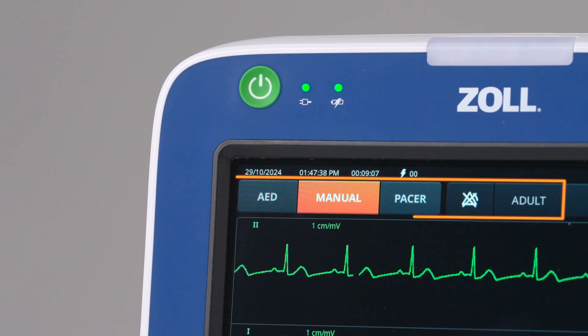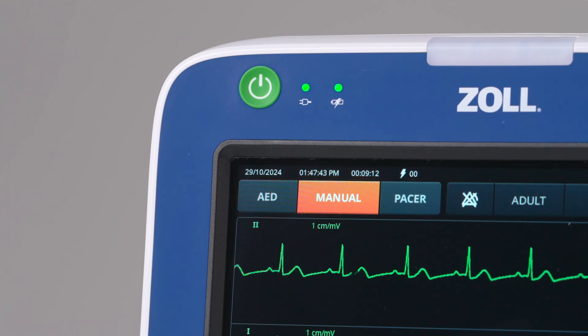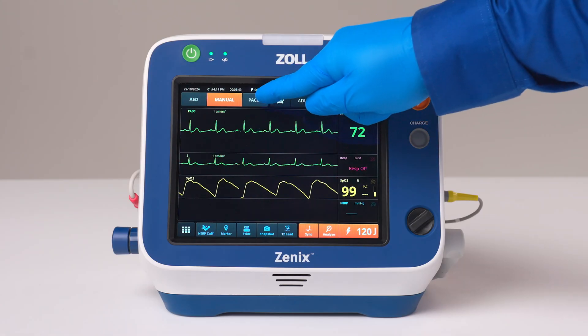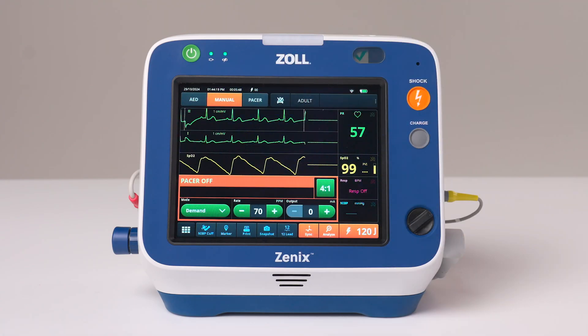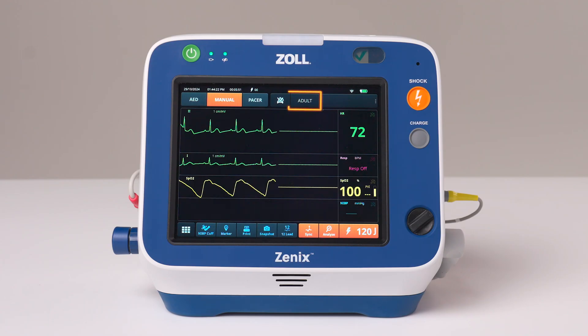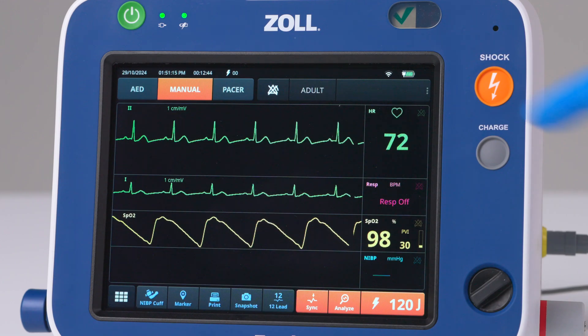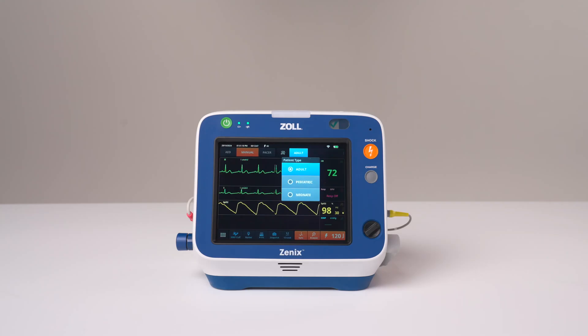The navigation bar shows three device modes: AED, manual, and pacer. Zenix will default to either AED or manual mode based on configuration. The patient type key displays the patient mode in use – adult, pediatric, or neonate. When patient type is changed, alarm limits, target inflation pressure of the blood pressure system, and initial defibrillation energy settings are automatically set for the patient type selected.